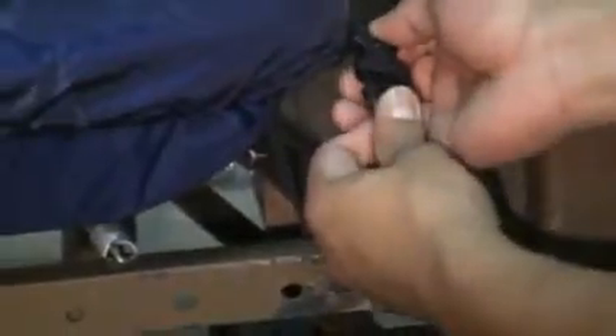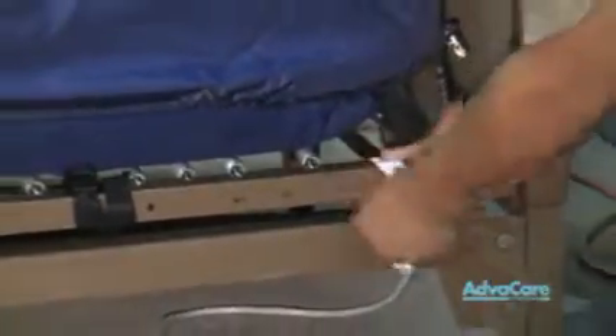You will have quick release clips in order to release the straps from their location. Any excess straps, simply wrap around the bed deck so they do not hang freely. There will be 10 straps in total for you to strap your safety bolster sheet to your bed deck.